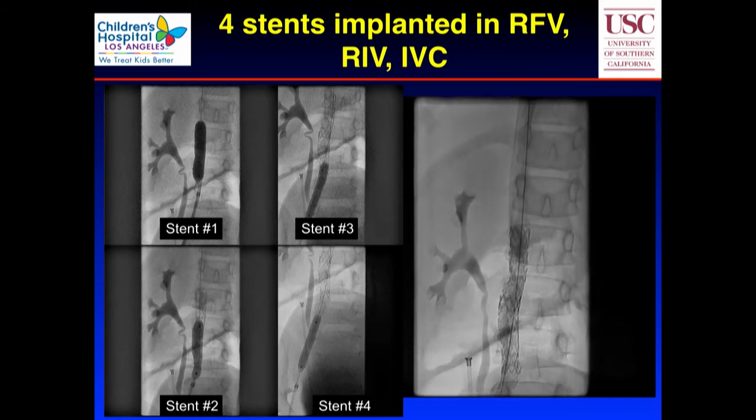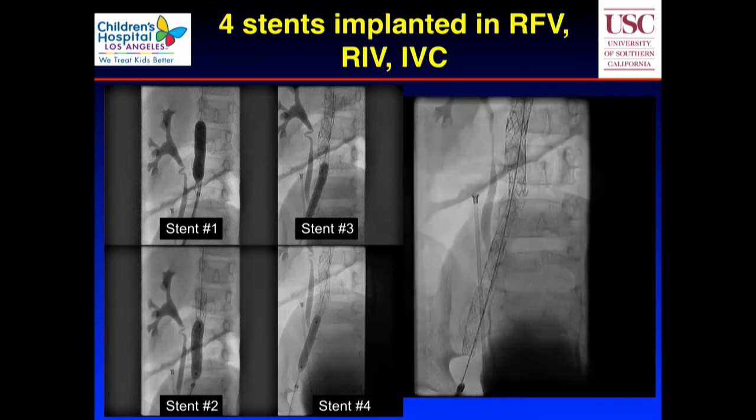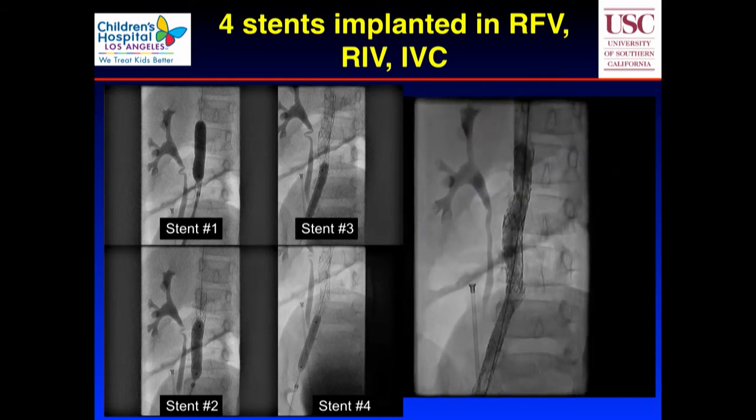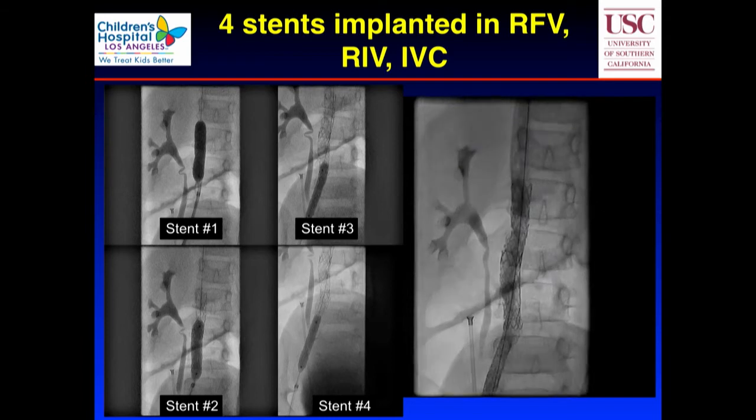That's what it's supposed to look like. That's what we all have. But remember how it looked before. You didn't have any flow in there, and you had all these little tortuous vessels, but you've reconstructed this. Now you can actually use this again for the future.